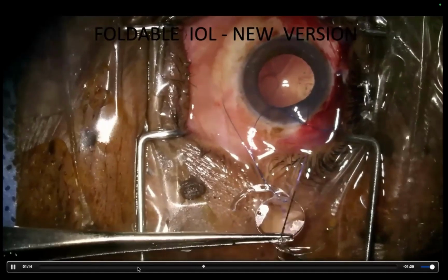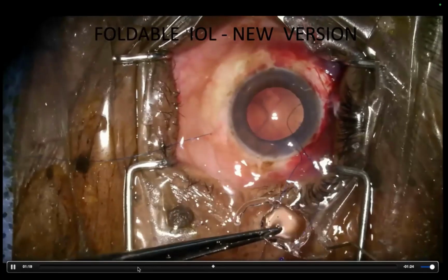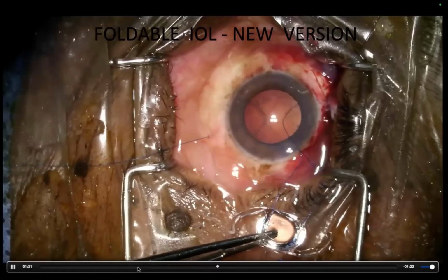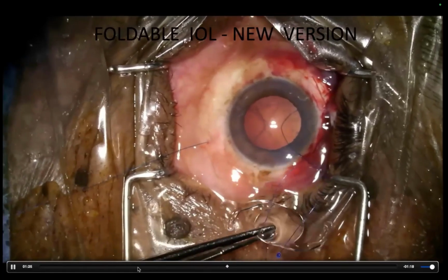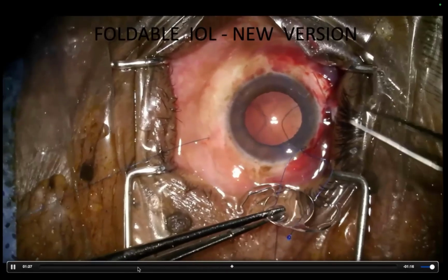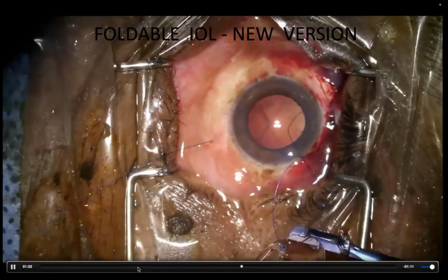So the optic-haptic junction, you hold the forceps close to the optic-haptic junction, because if you are not holding the forceps close and trying to puncture, what happens is the IOL is so flexible, it will just fold instead of puncturing. The needle will not puncture it. So wherever you are going to puncture, hold the forceps right close to it, and then puncture.